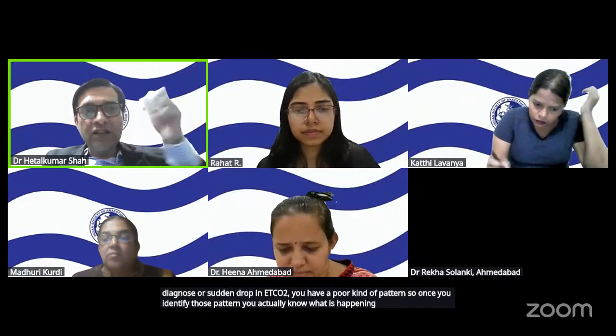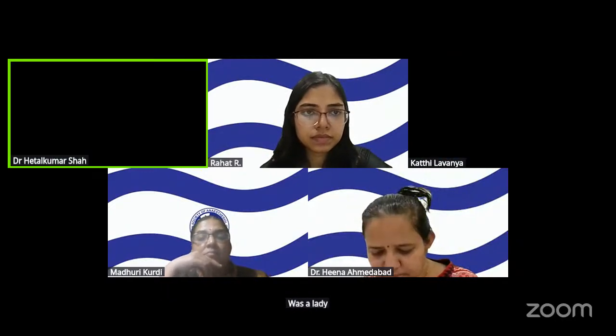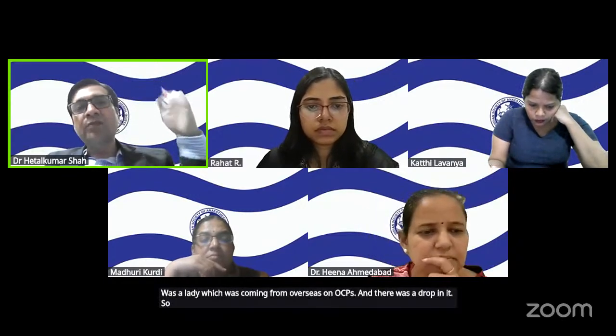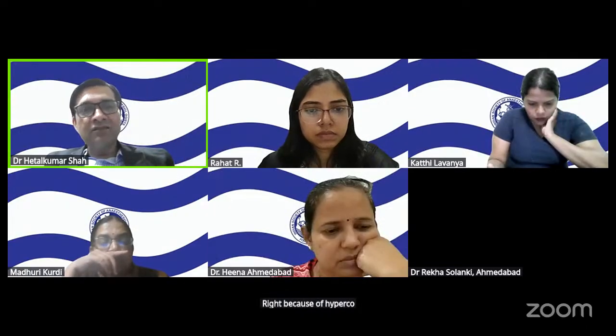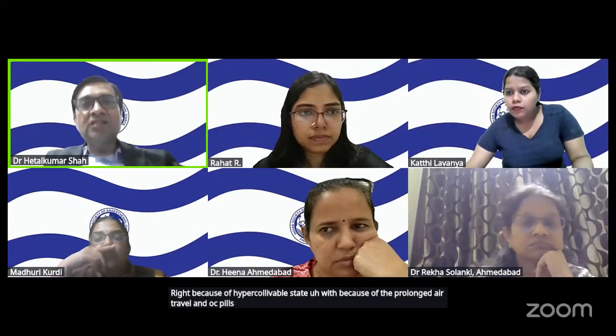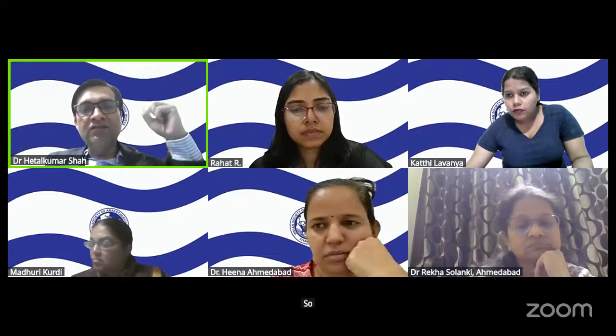Most of the time, in the case scenario which I put, the lady was coming from overseas on OC pills, and there was a drop in EtCO2. Most people would think of pulmonary embolism, because of a hypercoagulable state from prolonged air travel and OC pills. But that was not the case. So identifying those patterns is very, very important.